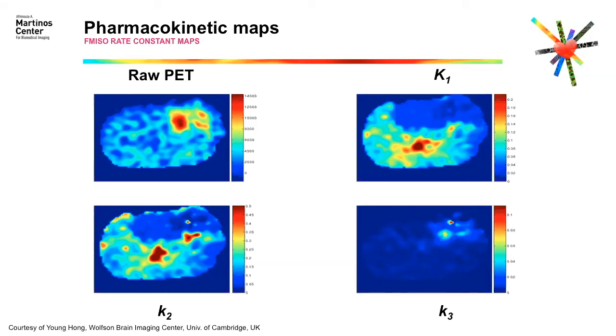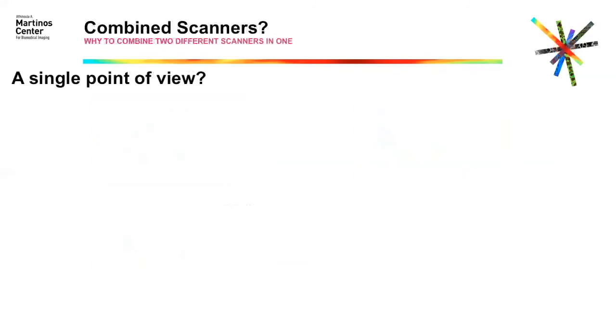You use the whole dynamic, the whole video picture of your PET emission tomography data, and you avoid those funny pictures that I was showing you before of having one single shot. And that's a beautiful thing that we can do with PET imaging. It's complicated, but it's doable.